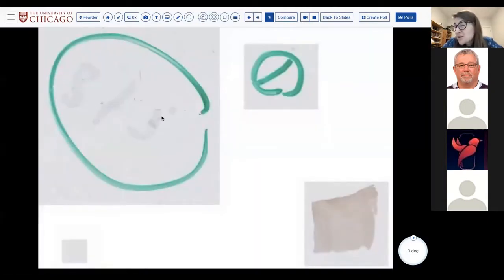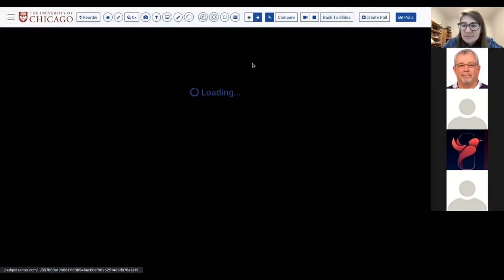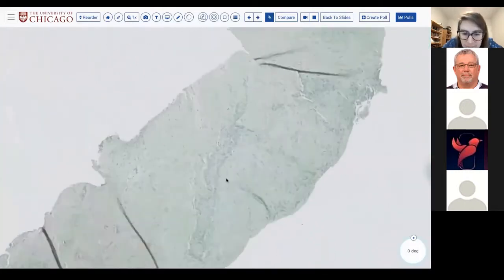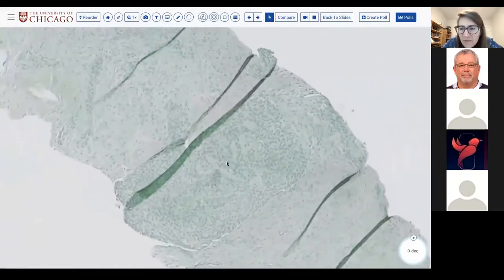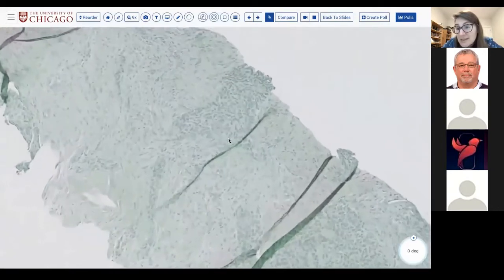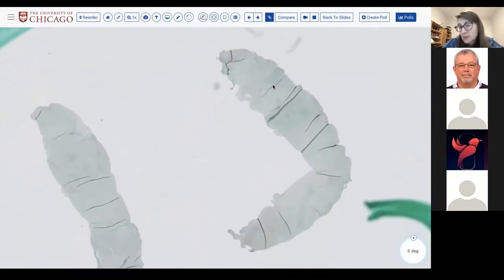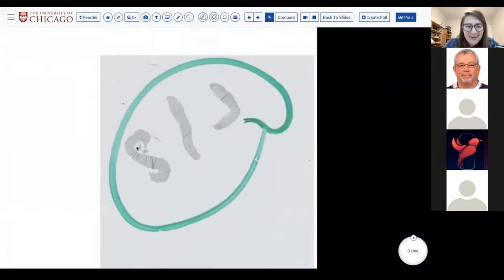With such diffuse strong P63, P40 in a parotid, do you want to think about mucoepidermoid carcinoma, even if you don't see mucin on H&E? I do. So here's a mucin stain. And other than combing through this with a fine tooth comb, I'm going to tell you there's no obvious intracytoplasmic mucinous vacuoles here. So this was a consult. So we got their light green.